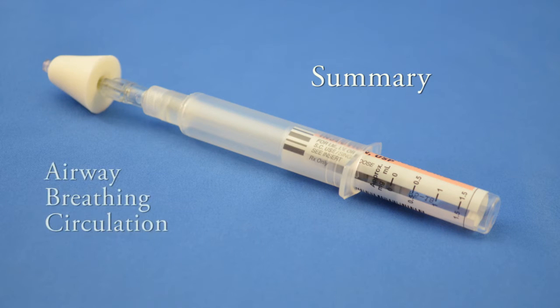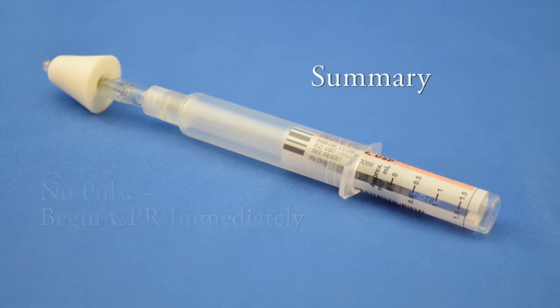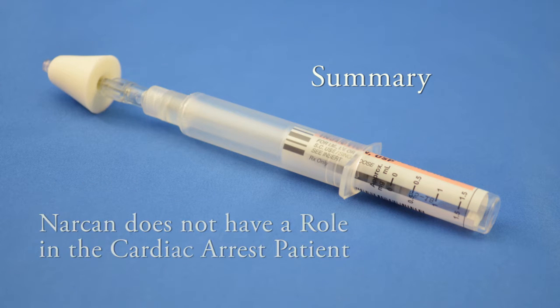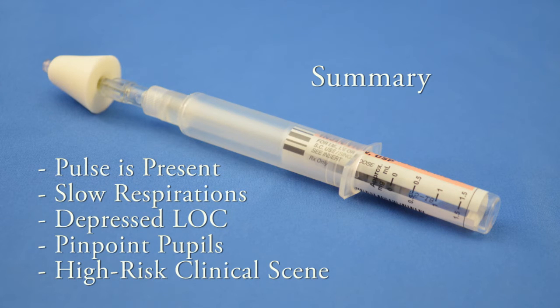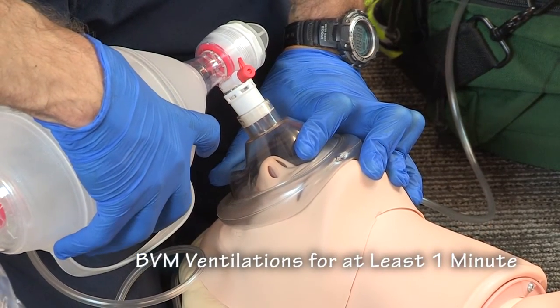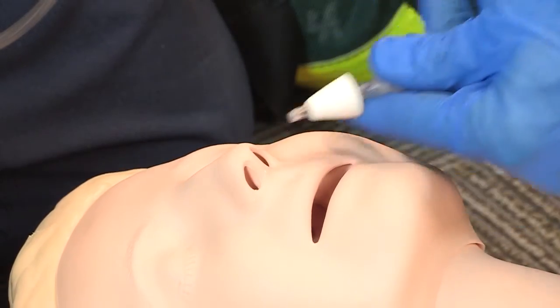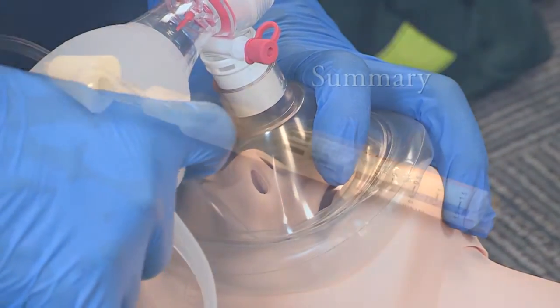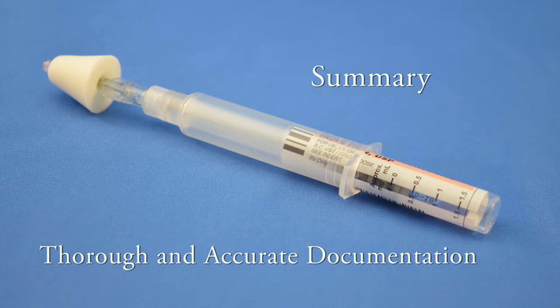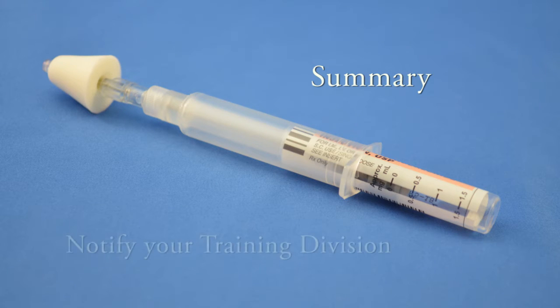In summary: the patient's airway, breathing, and circulation should be your priorities. If they don't have a pulse, begin CPR immediately — Narcan does not have a role in the cardiac arrest patient. If the patient does have a pulse and meets the criteria, your priority shifts to managing their airway. Ventilate the patient using a bag valve mask for at least one minute. Assemble and administer the Narcan and immediately resume ventilations. Remember to document the time that the Narcan was administered. Thorough and accurate documentation is required on all patients, and your training division needs to be notified on all patients who receive Narcan.